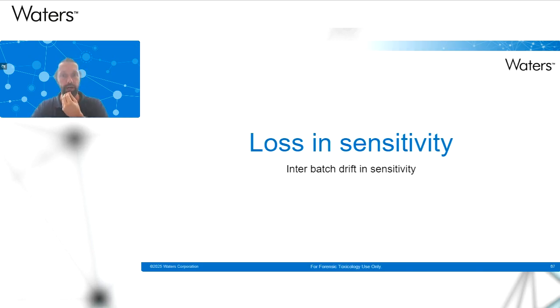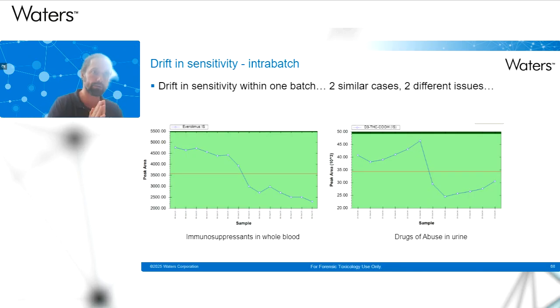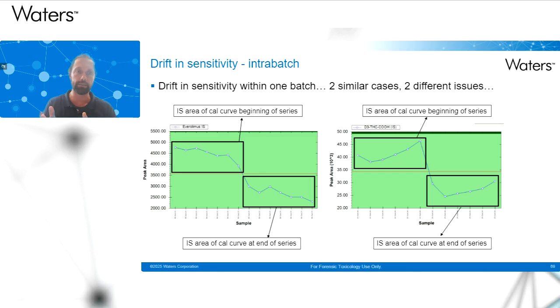So there's also another example, and this is about a drift in sensitivity within one series. And we have two examples over here. On the left-hand side, we can see the immunosuppressants in whole blood. On the right-hand side, a drugs of abuse method in urine. And what we are seeing is that a calibration curve was injected at the beginning of the series and at the end of the series. And in both cases, the sensitivity of the internal standard is lower at the very end of the series. So two similar cases, but two different issues that were going on.